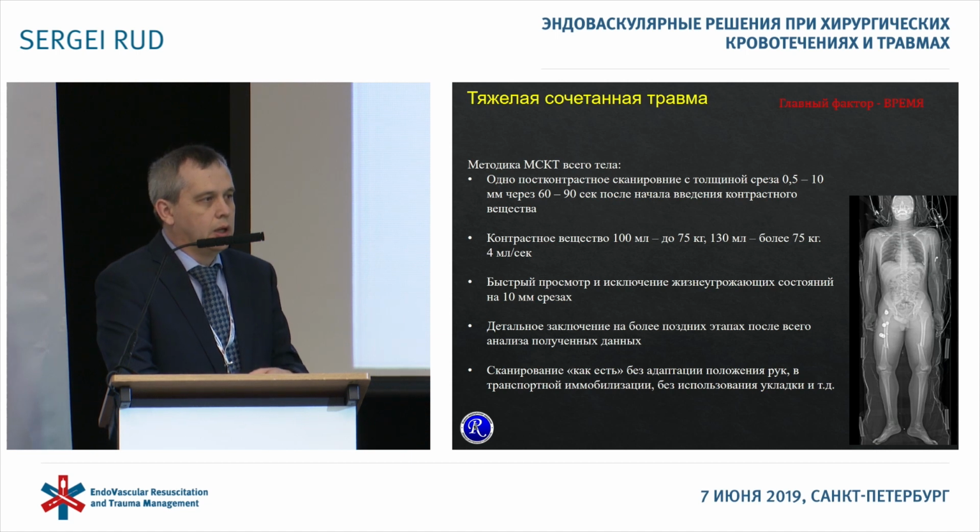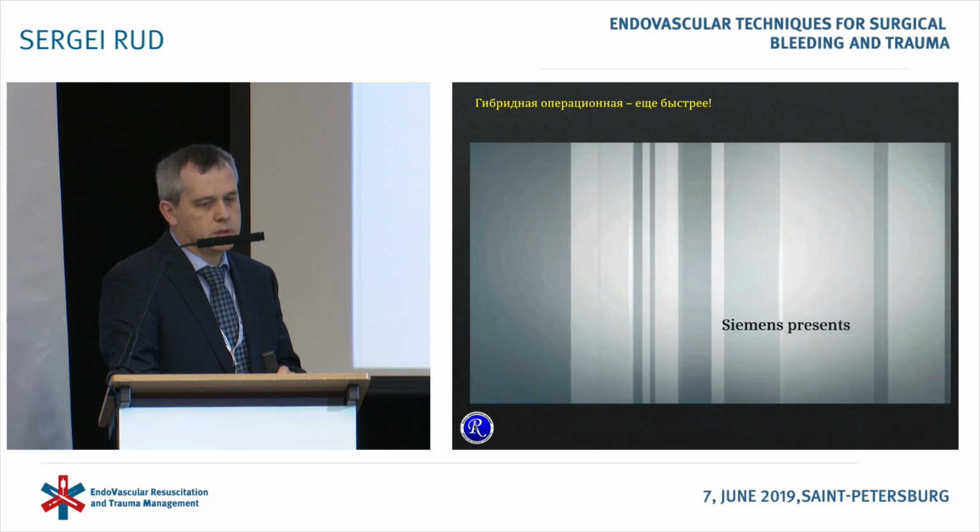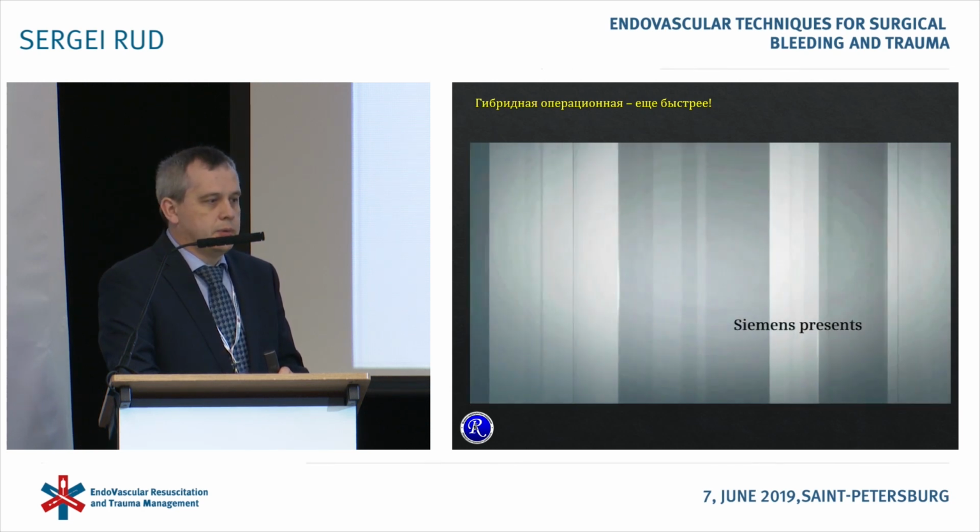Very often the blood pressure will be very low in such patients, so the deferred scanning allows us to diagnose the extravasation of the contrast more often. 10% of cases unfortunately remain undiagnosed, but up to now this is the best protocol we know.